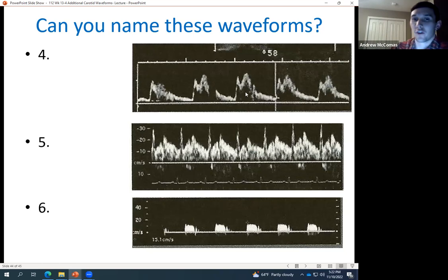That's the bad version of what you said might naturally have, the second little hump. Yeah. When that second peak is higher, this is pulsus bisferiens.